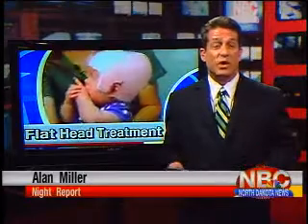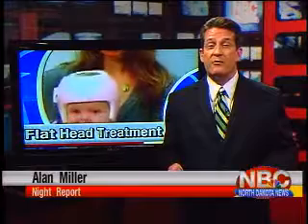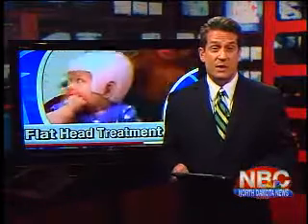No parent wants to see a child cry and squirm during an uncomfortable but necessary procedure. Medical reporter Julie McDonald visited Great Plains Rehab to learn about new technology that makes treatment easier for babies with flat head syndrome.